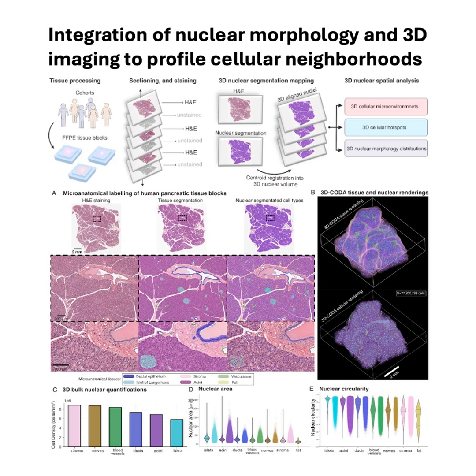Another point is the reliance on H&E staining. While it's the standard and tells us a lot about morphology, it does have limits. It doesn't give you deep molecular information about the cells. Right, it tells you shape and general type, but not what genes are active. Precisely. It limits the granularity, the cellular features you can extract. It tells a big part of the story, but not the whole molecular story. So where does it go from here? What are the next steps to build on this?